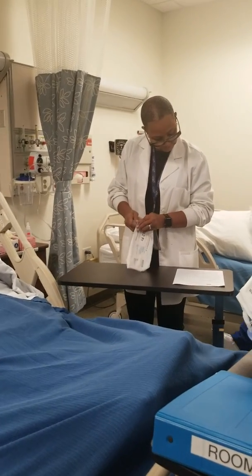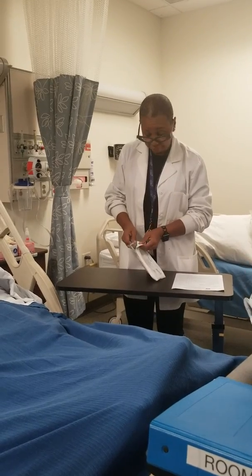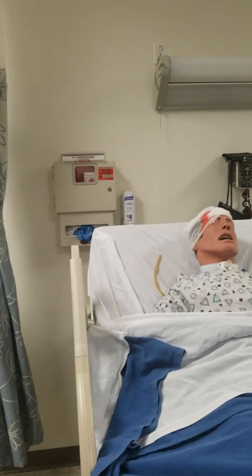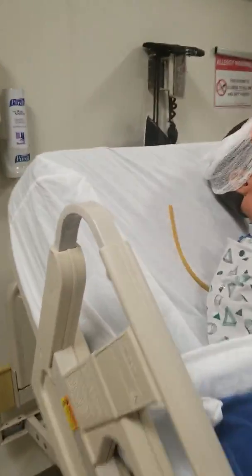Sterile gloves. A drape. I don't have any drape. May or may not need it. I need saline. I need a drape where? Across the patient, because he's gonna have a secretion. So go ahead and drape the patient.